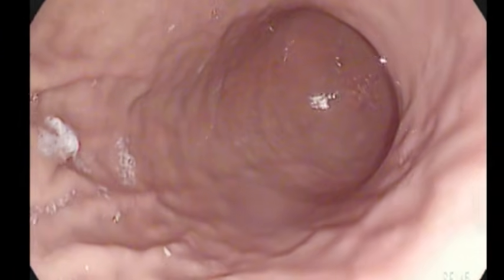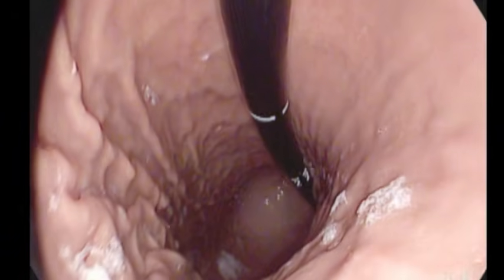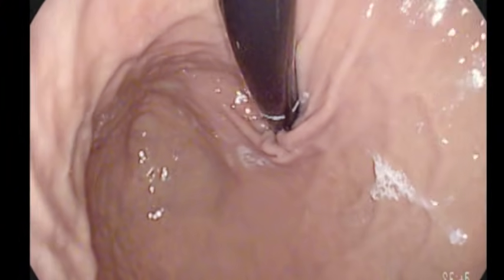As the scope progresses towards the pyloric region of the stomach, slow peristaltic contractions can be seen. These contractions function to churn gastric contents in preparation for entrance into the duodenum. The gastroenterologist now turns the scope around for a retroflex view of the cardiac and fundic stomach, an important routine procedure used to check for gastric ulcers and other pathological disruptions to gastric epithelium.